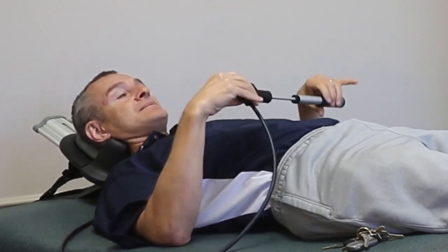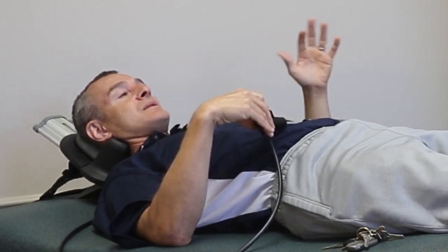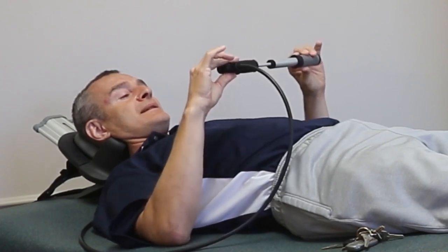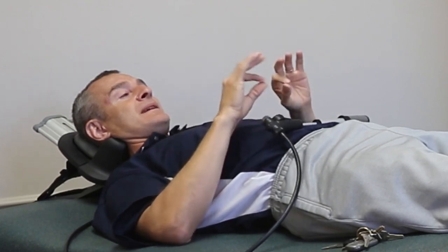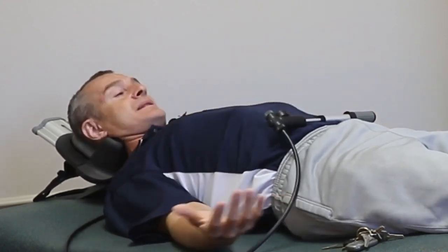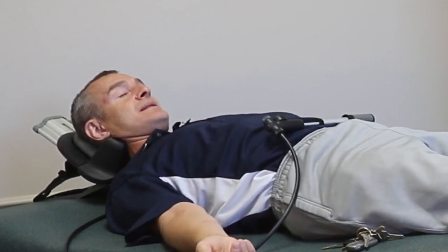So at this point, let's say I leave it on 5 pounds for a minute or two, totally relaxed, no symptom, irritation, no problems. Maybe I decide, hey, I want to go up a little bit more, so I'm going to take it up. And right there, I'm sitting between 8 and 9 pounds. That's just absolutely perfect. I feel the distraction, I feel it tilting my head. It's not sliding or moving or doing anything uncomfortable. I would typically ask my clients to turn their palms up because that opens up the chest and the shoulder. I might ask them to readjust and squeeze their shoulder blades back, tuck them underneath their body, and then just rest in this position.